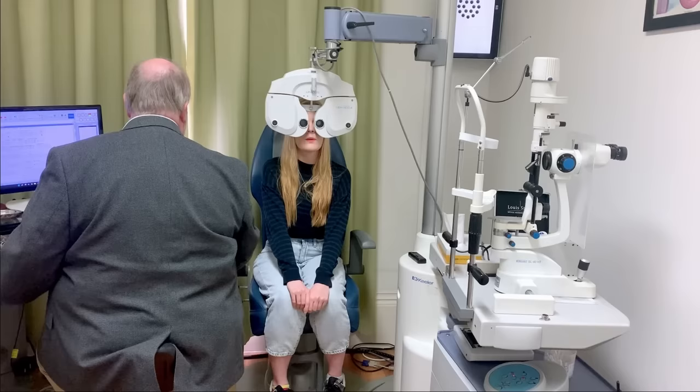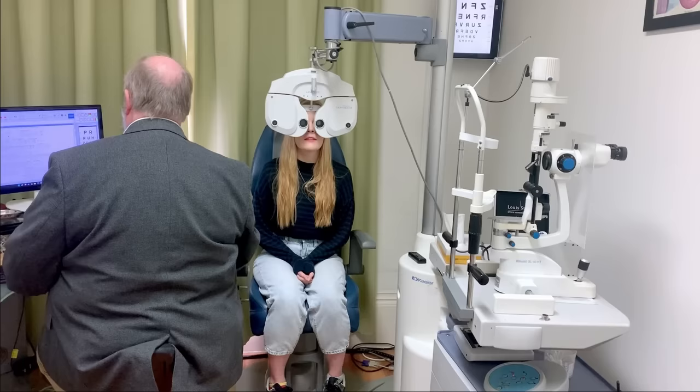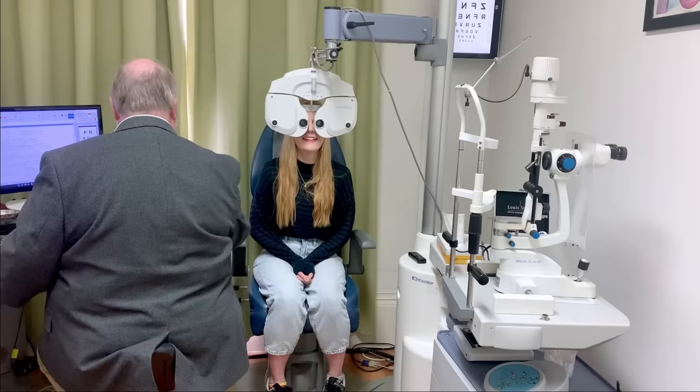That looks dotty again for you. Yeah, it's really clear now. And if we go back to the letters, can you see the bottom one? Yep. U-V-H-R-Z. Well done. It's actually easier on this side. It feels a bit easier, does it? Okay. Any sharper there? I don't think so. I think this one's sharper. Is that a bit better? Okay. Any clearer here? With the first one? This one's clearer. That one's better. Or does it just look a bit blacker? It's like same difference. Yeah, pretty similar. Okay.